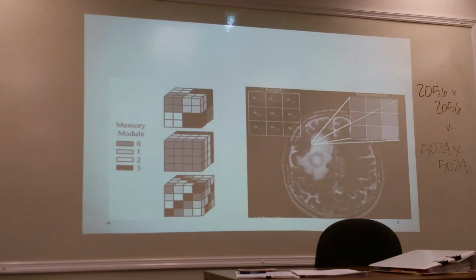And so, again, you can see just a little bit of an area of a radiographic image contains lots of shades of gray. And what do we call that, showing shades of gray in a system? Low contrast? We don't use the word contrast. We're going to use what word? Resolution? Contrast resolution, very good.